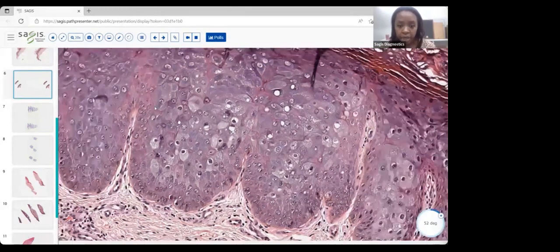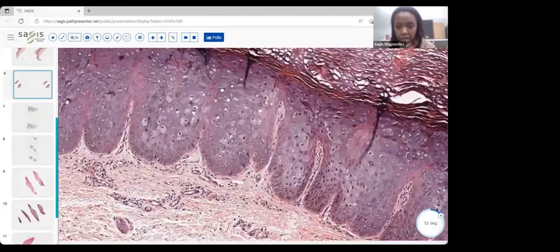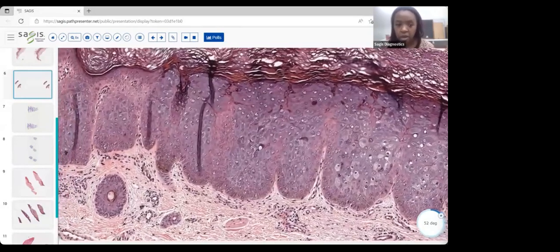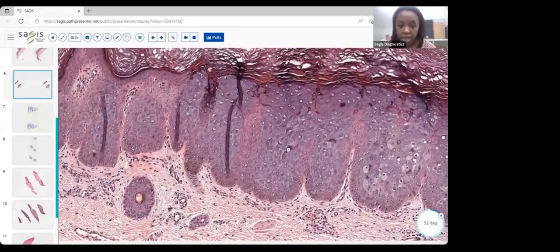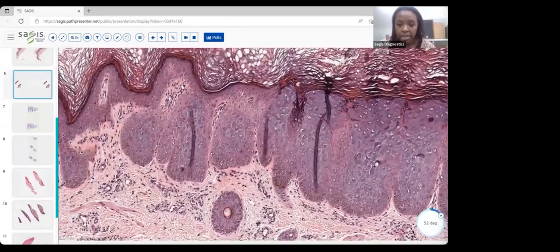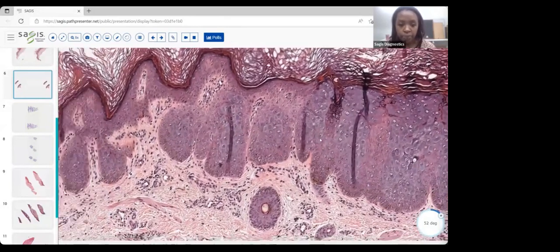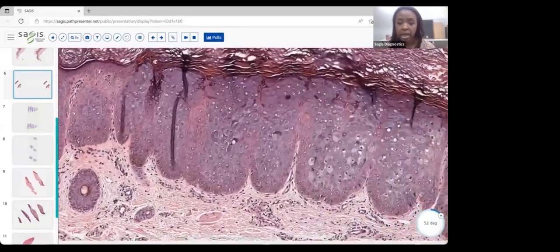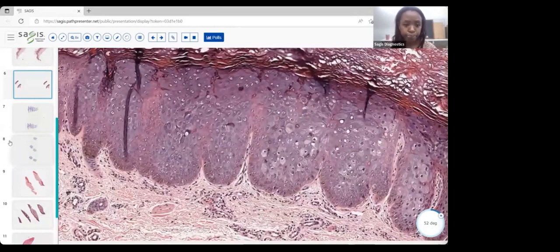Now, as you know, EDV and HPV are related infections. There are certain HPV subtypes that are associated with it, but squamous cell carcinoma can arise from these, right? Squamous cell can arise. So you want to look around and see if you have evidence of clear atypia. Just don't forget that, once you've made the diagnosis of EDV, great, yes. But at the same time, just be aware that a malignancy, a frank SCC, can arise from this. Okay.